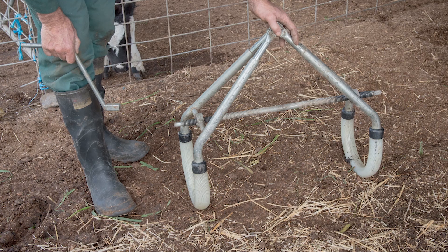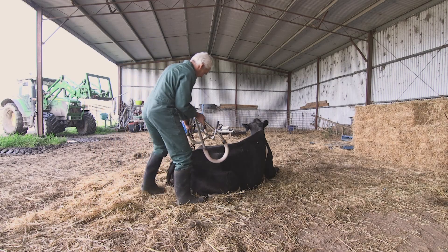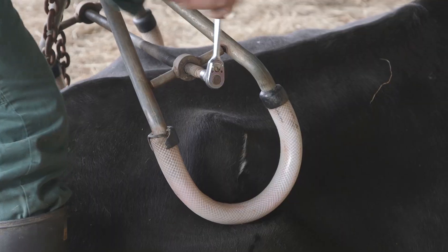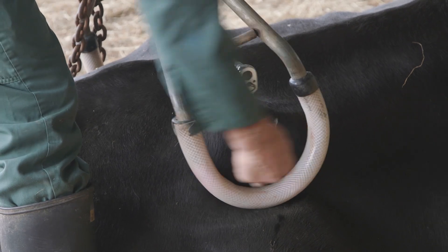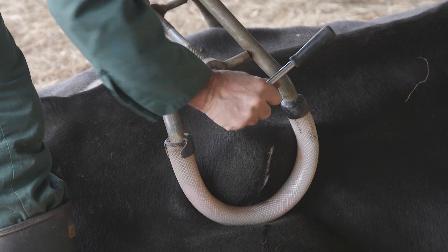In this video we'll show how to lift a cow using a hip clamp. Approach the cow from behind and apply the hip clamp to the wings of the pelvis. It needs to be done up firmly so that the cow doesn't slip out and cause damage to the pelvis. Ideally the hip clamp will be padded to also provide extra protection to the cow.